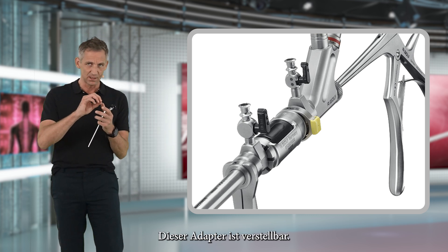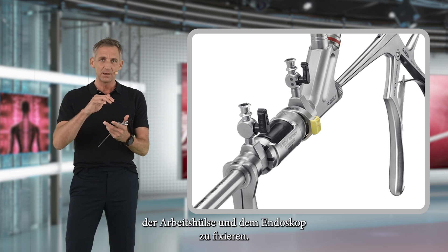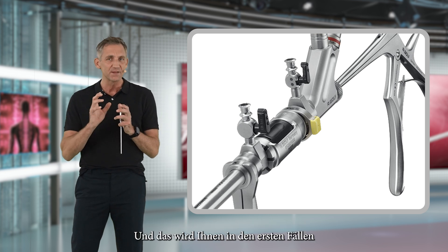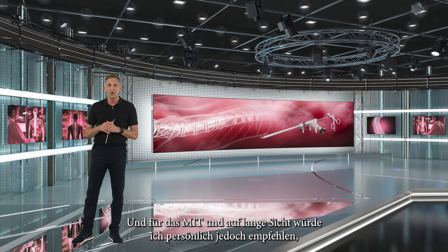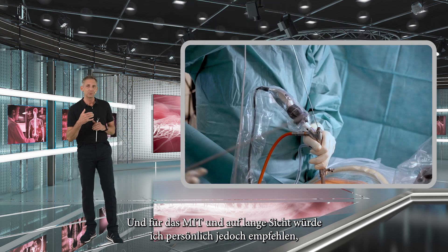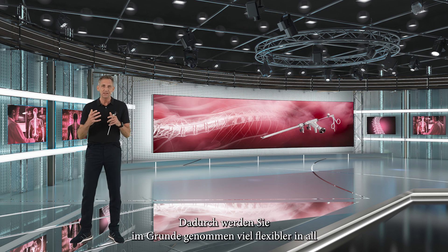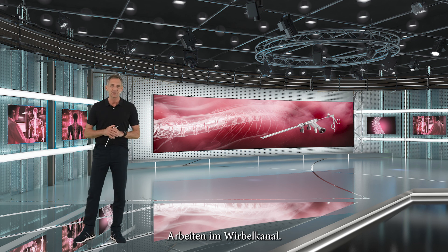This adapter is adjustable, and what it does is basically fix the distance between the working sleeve and the endoscope, so that is at least one less thing for you to take care of. This may make your life a little bit easier in the first cases. However, for the mid and long term, I personally would recommend that you teach yourself to use the endoscope freehand, as this will make all of your movements much more flexible and you will be much more mobile working inside the spinal canal.